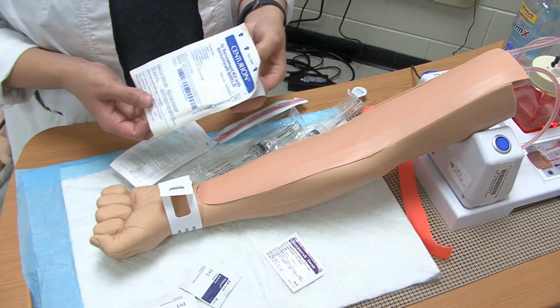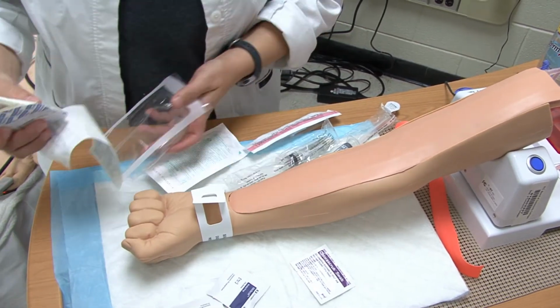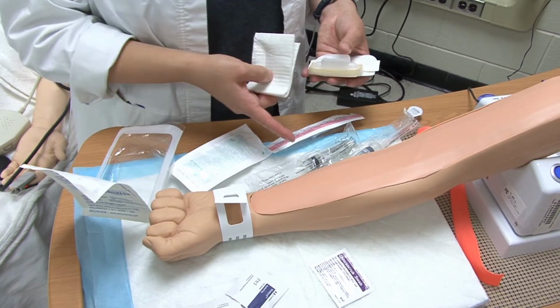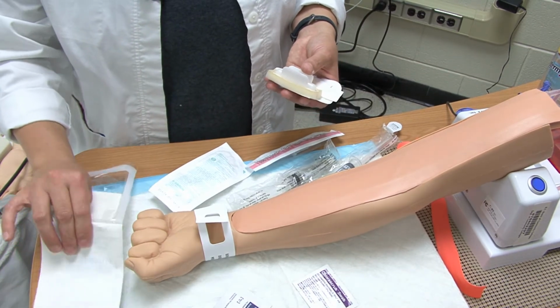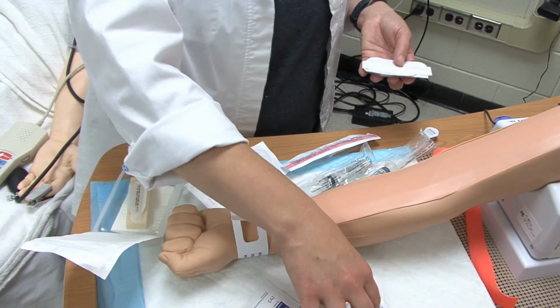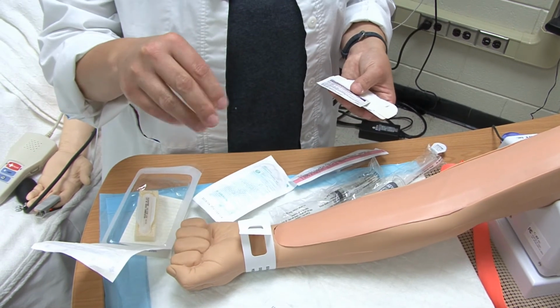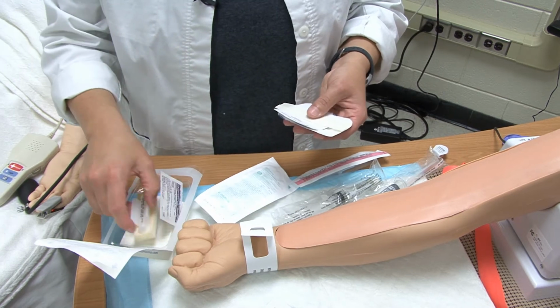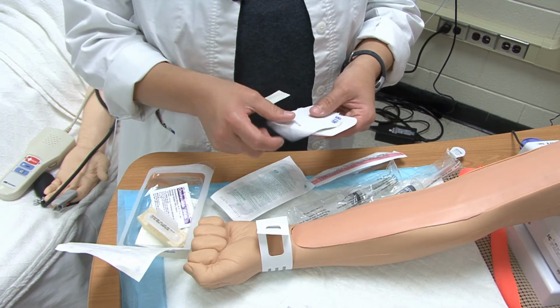So I've already got my IV initiation kit, from which I had pulled my tourniquet out. I'm going to go ahead and open it, and I'm going to take out the pieces that I will need here. I've already got a waterproof pad underneath my patient's arm, but this kit actually had one if I needed it. Some of the kits come with that, some of them do not. This one actually has a scrub in it. Some of them will come with a ChloraPrep swab instead, or they may have one of the little glass swabs in it that you'll actually break. You want to make sure that if it does have one of these, you don't handle this piece because it could contaminate it before you clean the patient.